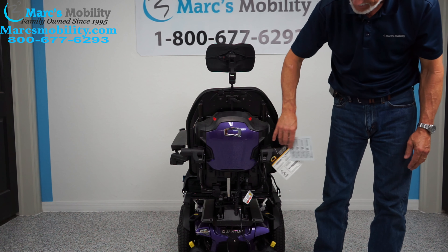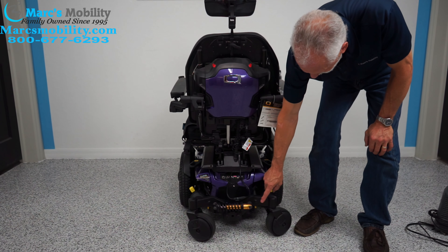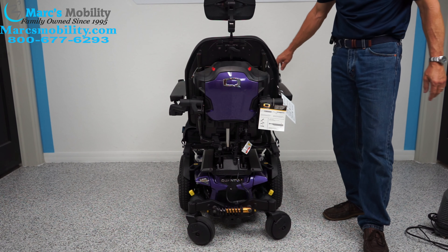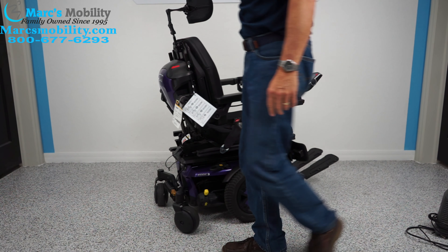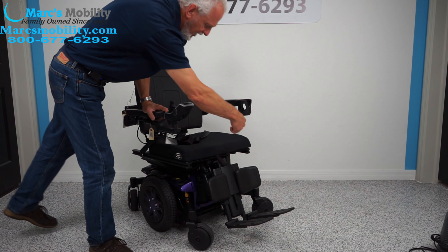I want to show you the suspension in the back — look at that suspension. It takes care of the front and back forks because they're independent forks. You have the same suspension in front — you have two more in front, one here and one on the opposite side.